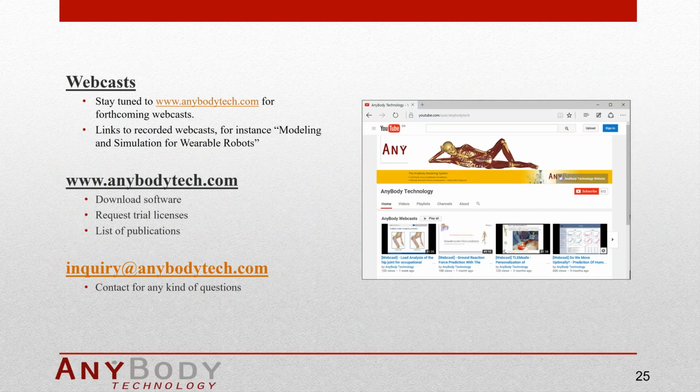Okay, thanks very much, John, for the very nice presentation. Personally, I really like the idea of categorizing exoskeleton design into actually 3 phases: baseline, as you mentioned, conceptual, and detailed design. So I think this might be very inspiring for the exo designers and how they can study the influence of the exoskeleton on the human body.